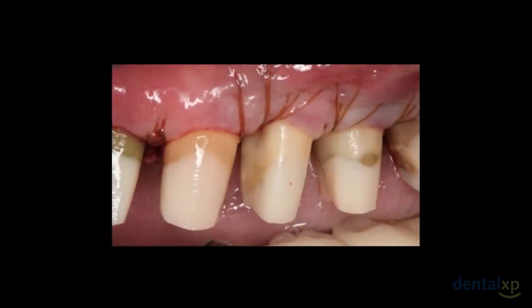Here we have sutured our tissue in place. It is critical, in my estimation, to try to do periosteal suturing of your flap. The reason being is you can then place the flap wherever you want and know that it will stay there. In this case, we have placed the flap just coronal to the bone. We never want to expose bone if possible, other than in the very middle of the tooth where we can't prevent it, but we certainly don't want to expose bone on the buccal or lingual.